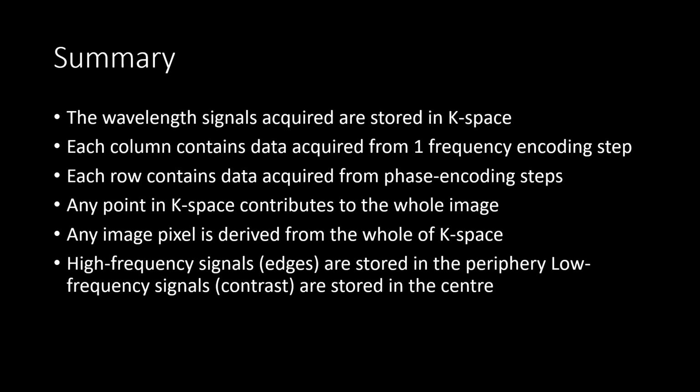K space is nothing but a time amplitude domain when we measure an image. This K space is filled by taking multiple echoes with different phase gradient frequencies, and then we plot with respect to time and amplitude at each phase gradient, and that's how we fill the entire K space of time amplitude domain.